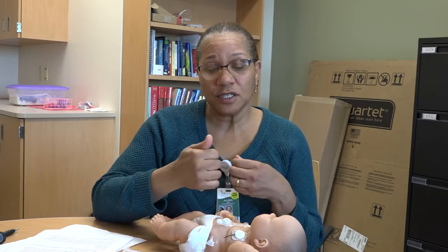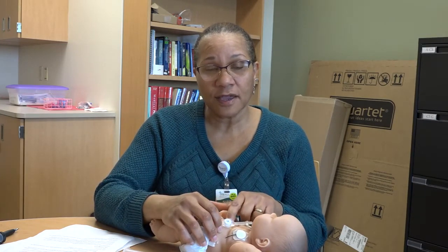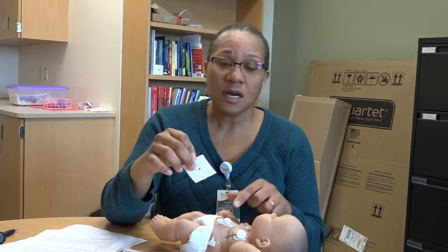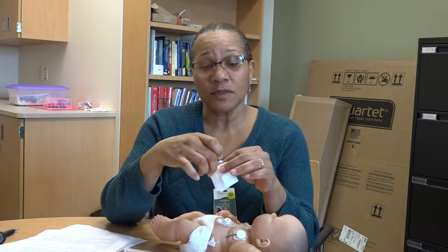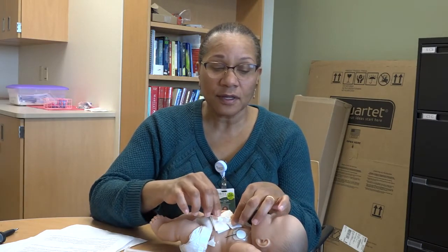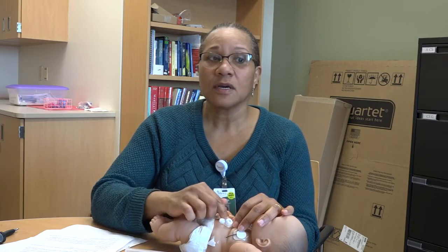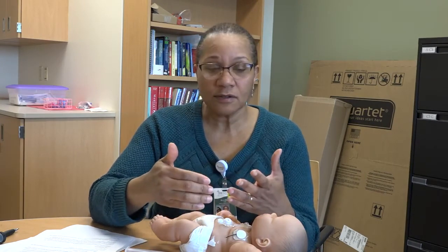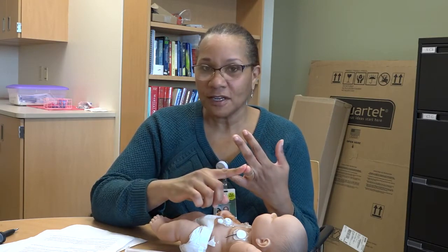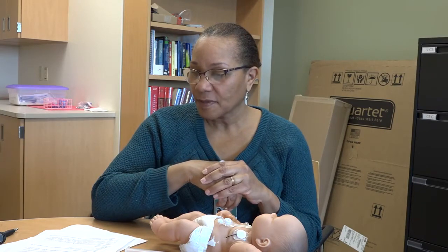And so those are things that we really can't do anything about. We just need to support the child and the area. We might need to change our 2x2s more frequently. If at all possible, we might need to use more than 1 or 2 2x2s and try to support that area a little better there. If we're seeing irritation because of the increase in drainage, then we need to support the skin by using barrier cream. But there isn't anything to do until the child gets better. They're not sneezing anymore, they're not vomiting anymore, they're not coughing anymore, those types of things.